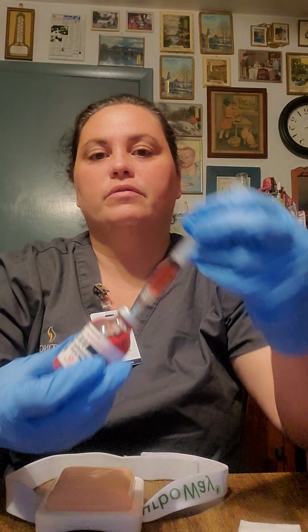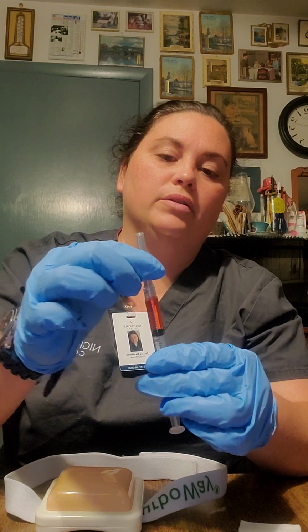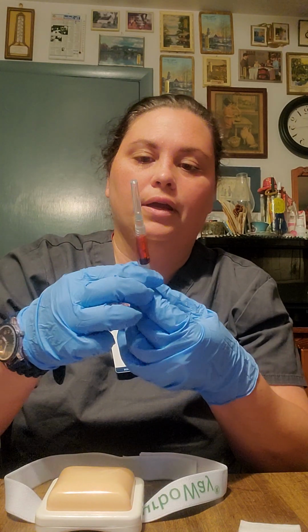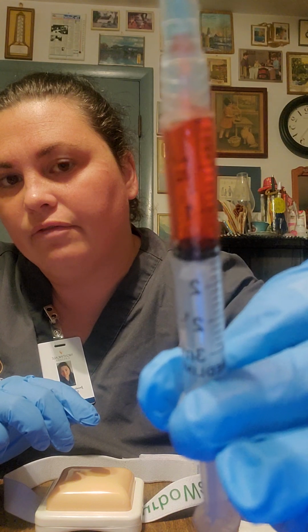Okay, I'm going to flip this over. I would then pull this straight up and out. Okay, now I would do the scoop with the cap here. So I would scoop it and up, press the top on, and then I can show you here my 1.5.